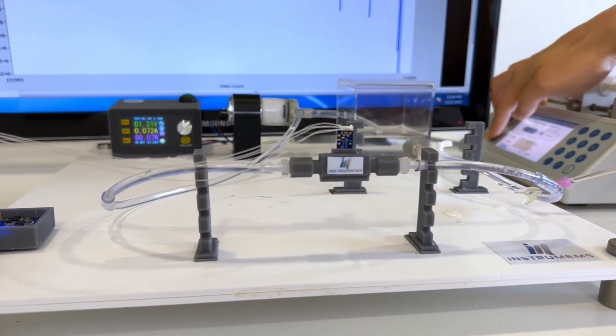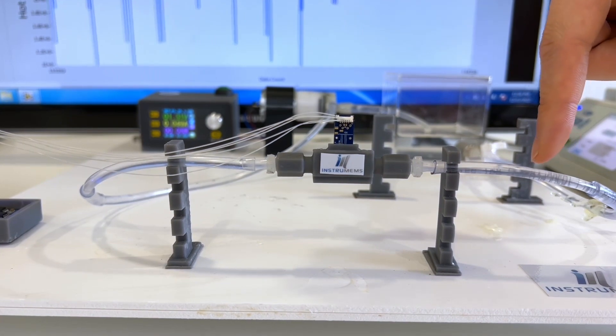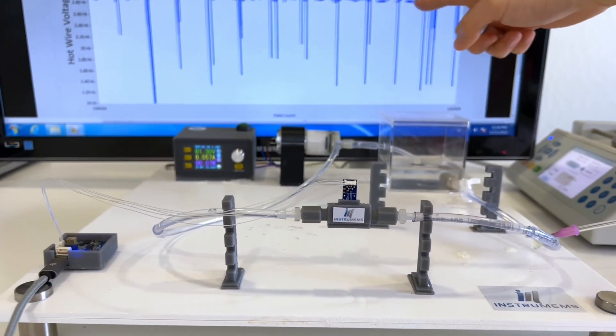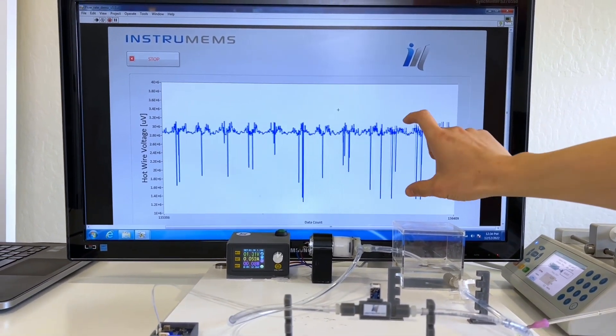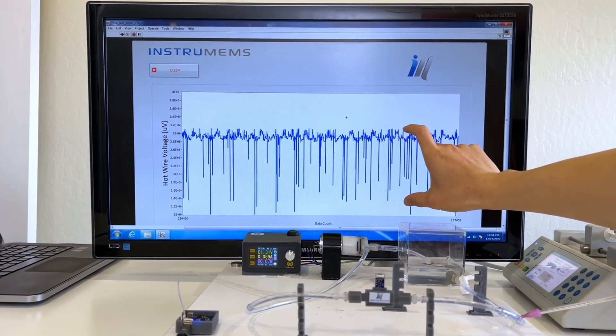You can see bubbles of varying sizes passing through the sensor. The display shows the sensor's response to the bubbles. The voltage output swings low every time there is a bubble present.